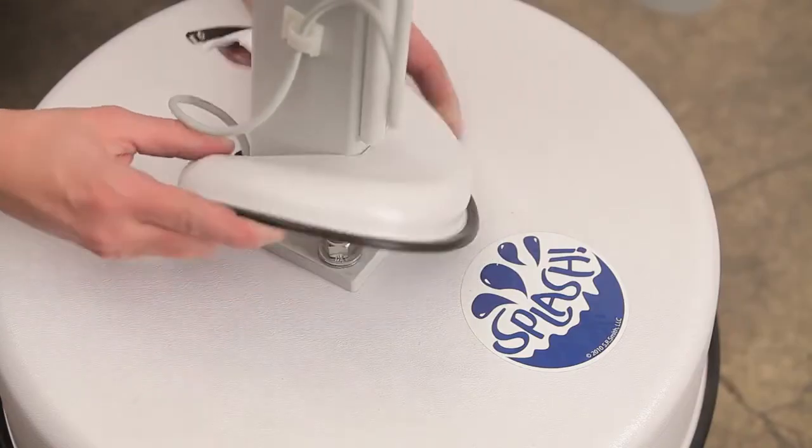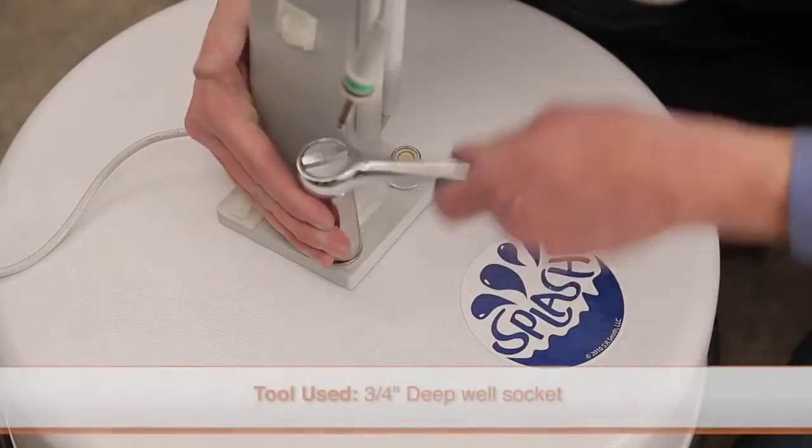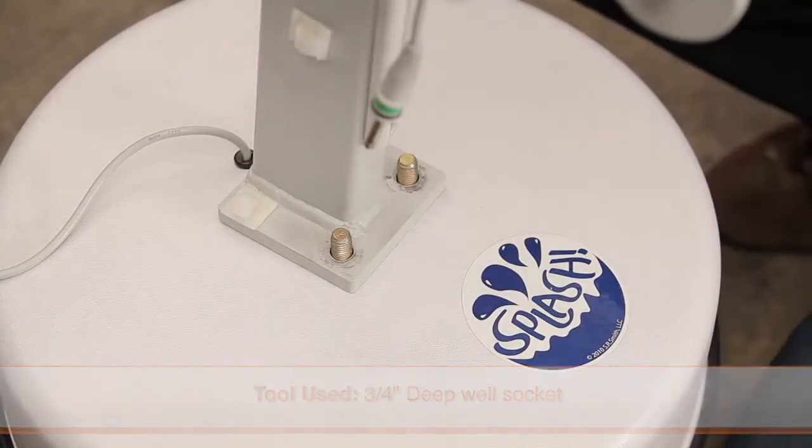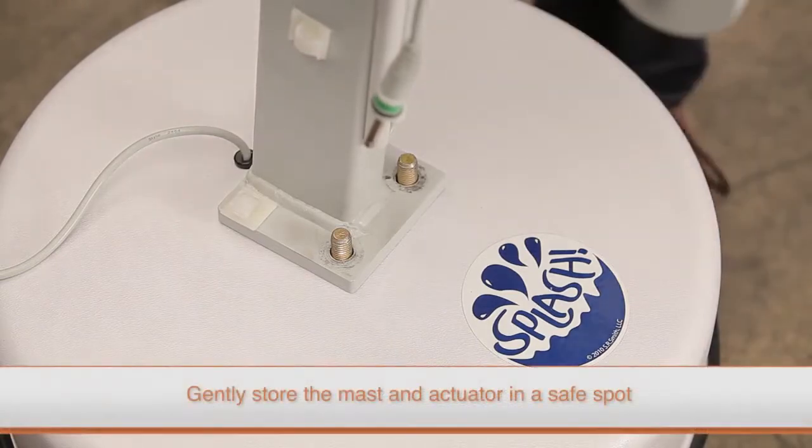Now remove the mast. Use a deep well socket wrench to remove the nuts attaching the mast. Remove the mast assembly and be sure to place it so that the actuator arm does not get damaged. Finally, remove the lift cover.